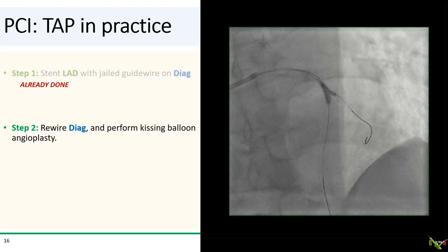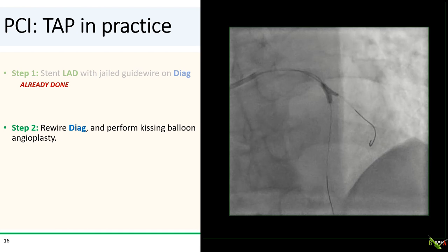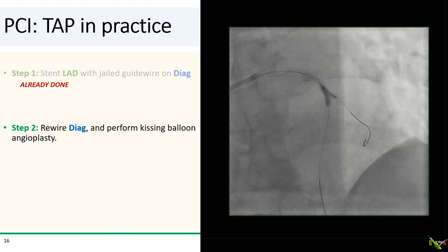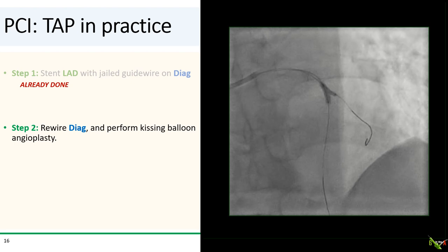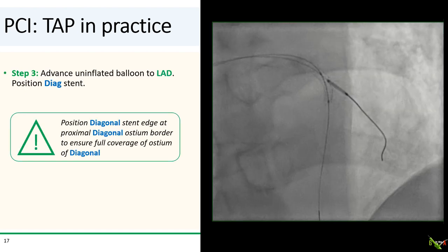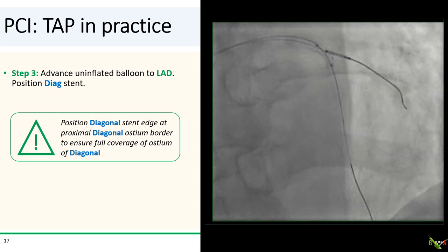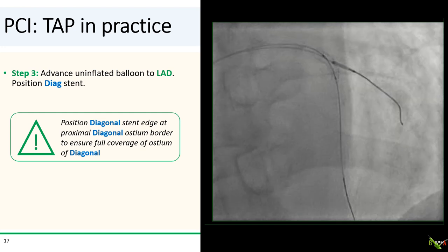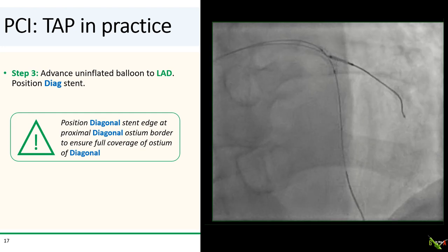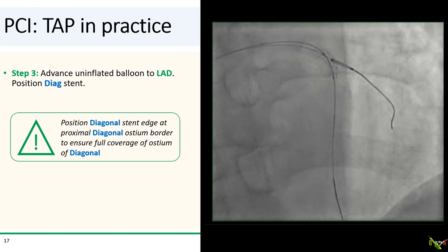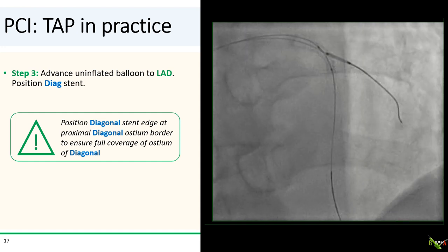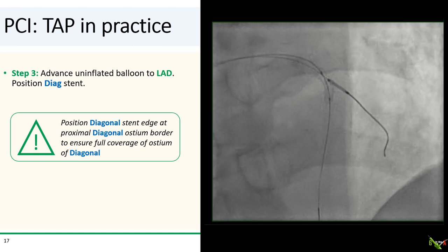Now let's see how this works in our patient. We've already done step one — we've already stented the main branch, the LAD. In step two, we rewired the diagonal branch through the LAD stent cell and performed kissing balloon angioplasty, which dilates the LAD stent cell to allow passage of a stent into the diagonal, while the kissing step reduces deformation of the rest of the LAD stent. In step three, we place an uninflated balloon in the LAD and carefully position the diagonal stent so that its proximal edge aligns with the proximal border of the diagonal ostium. You can tell where the proximal border of the diagonal ostium is by looking at where your diagonal stent crosses the outline of the LAD stent — this ensures full coverage of the ostium of the diagonal.